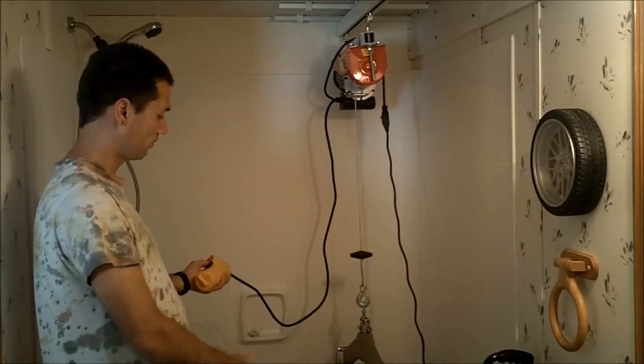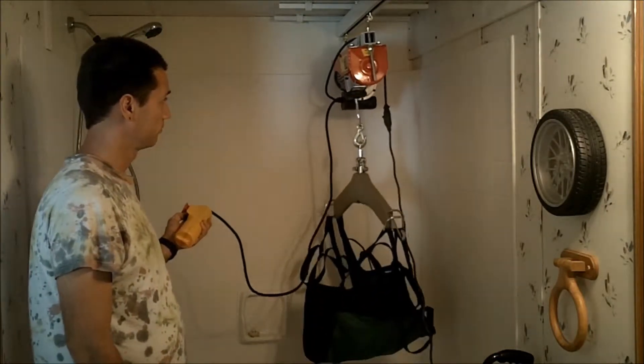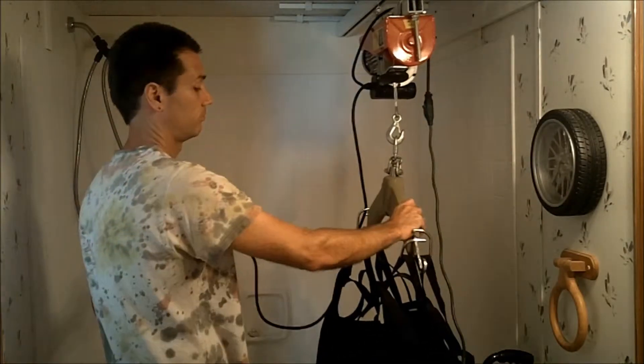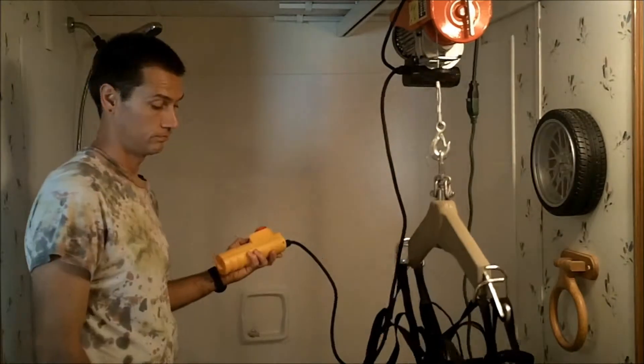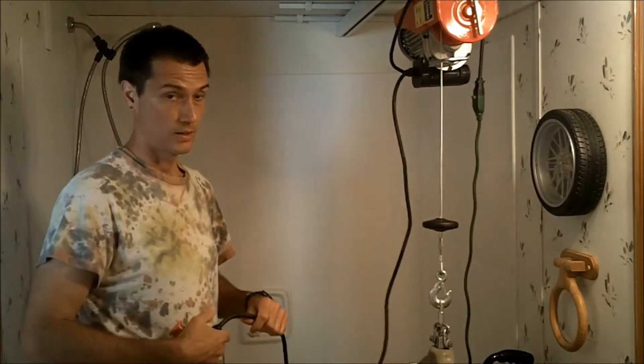Unhook it, bathe him, hook him back up, and he's out. Move it back over, unhook him again. Pretty straightforward.